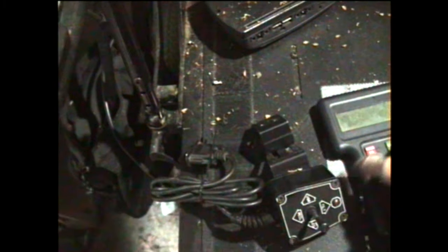So if you want to disable that, go ahead and plug the programmer in. We're going to press power on the programmer.